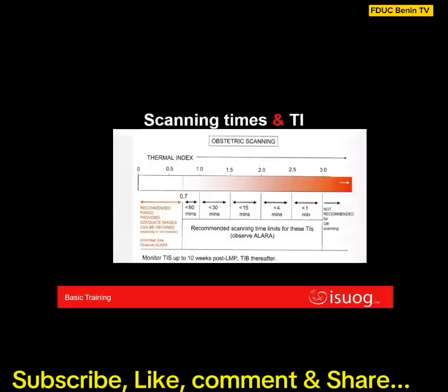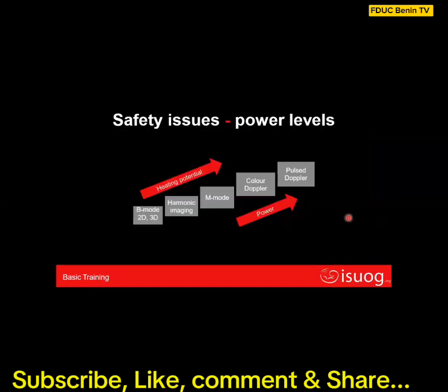This is showing us scanning time and thermal index. The thermal index is displayed on ultrasound machines. The more time you spend scanning, the more the exposure time, the more the thermal index increases, and the more heat is produced.